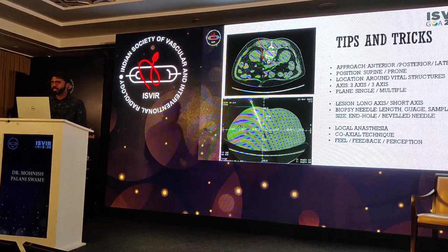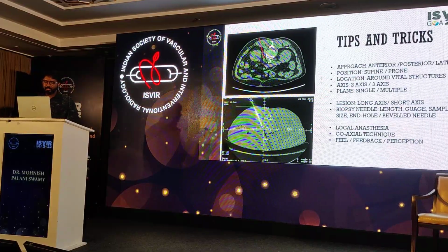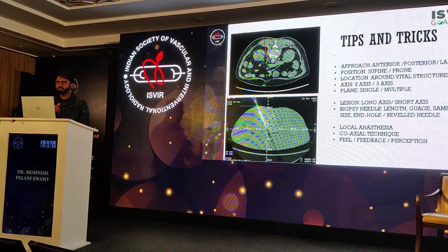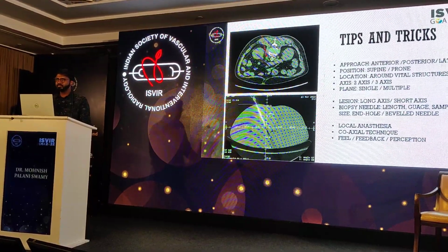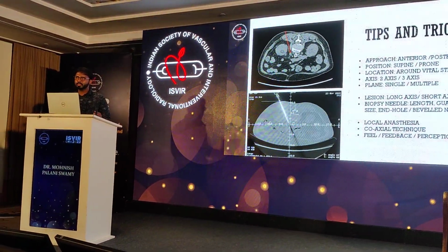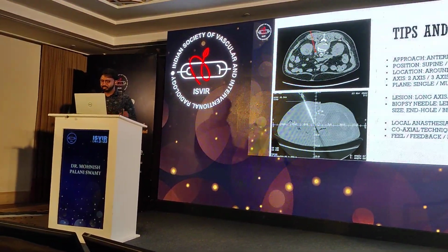And I always use a coaxial technique. And one thing that is very important is feel, or feedback, or perception. When you're going through the lesion, you have to feel whether it's soft, whether it's hard, whether it's firm. And once the needle is out of the lesion, you have to feel whether it's going near a structure.